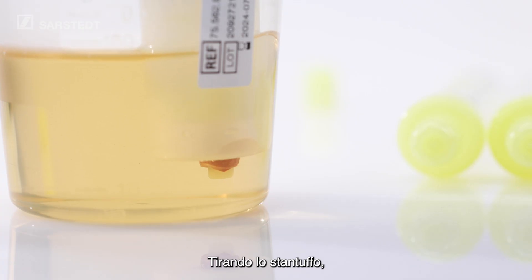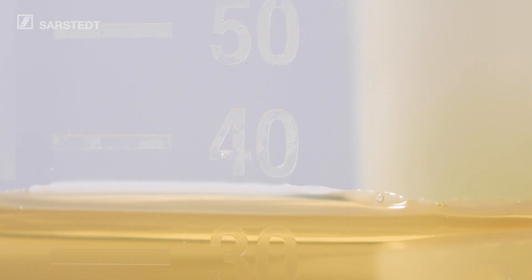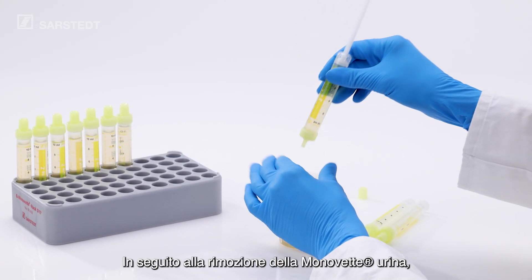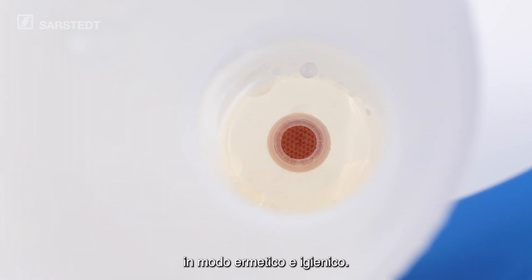By pulling on the plunger, the urine flows gently into the Urine MonoVet. When the Urine MonoVet is removed, the NFT Urine Cup is immediately, tightly and hygienically sealed again.